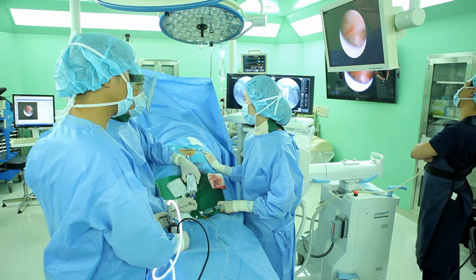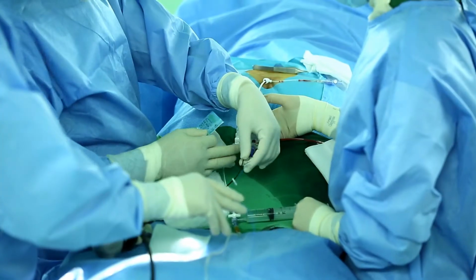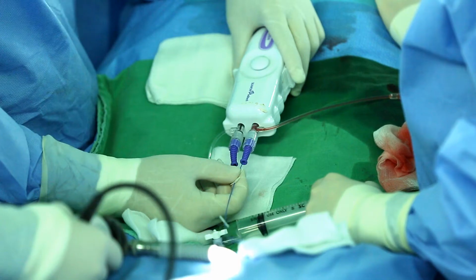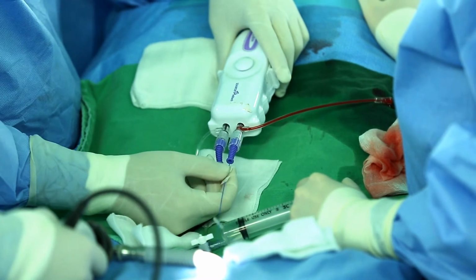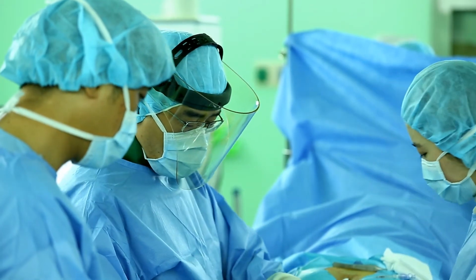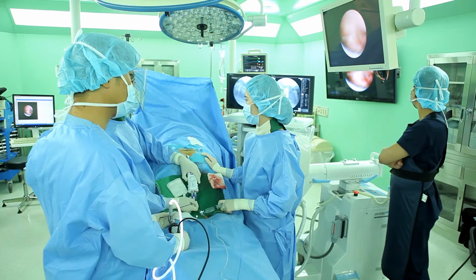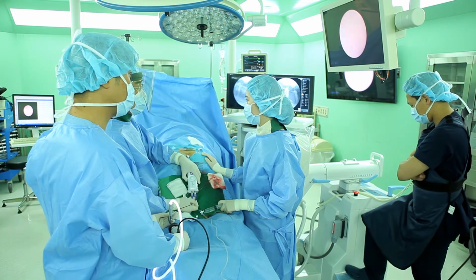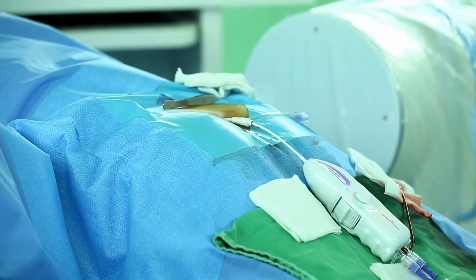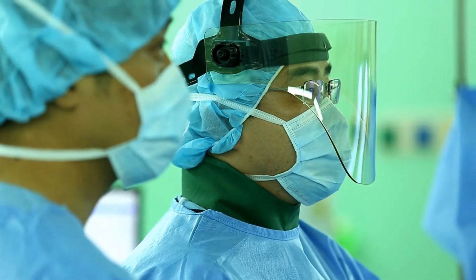This procedure is almost finished, but you're wondering when to finish this procedure. SELD procedure time fully depends on an SELD surgeon's experience because SELD is in a concept of decompression, not total removal of HNP, such as PELD and open discectomy. You should ask the patient before SELD if the patient has pain in the operative position, and it will help you to judge when you should finish SELD if the patient has pain.